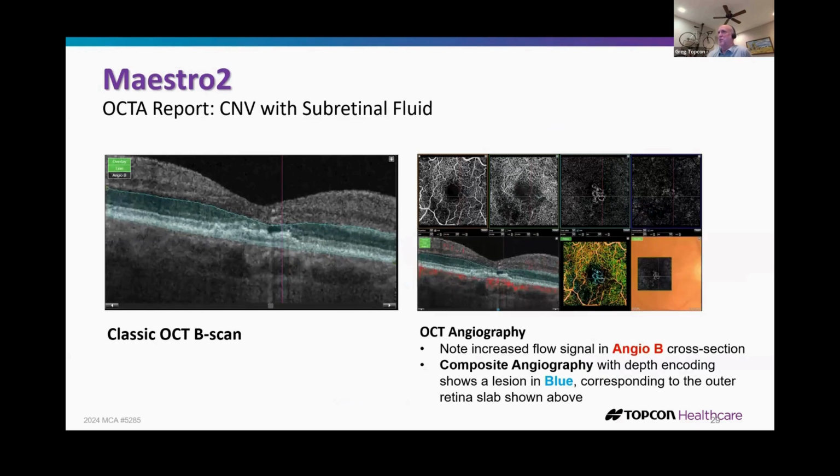This is interesting. So sometimes when you're looking at OCTs, you might get a report that shows you 2 whopping B scans. That's it. And you're going to make a split decision based on that. You may not be in the position to scroll through the scans, but with this image on the left, this is a classic double hump pattern that we see in CNV, little pocket of fluid there maybe, but your report may not be on that B scan. Whereas on the OCTA, same patient, it's pretty obvious something's going on with this patient.